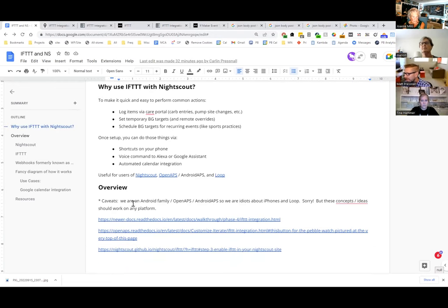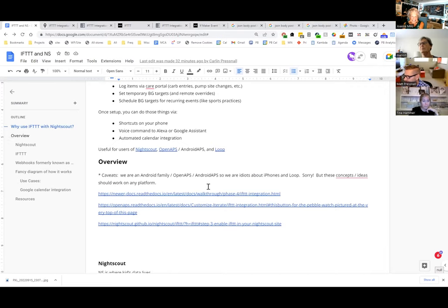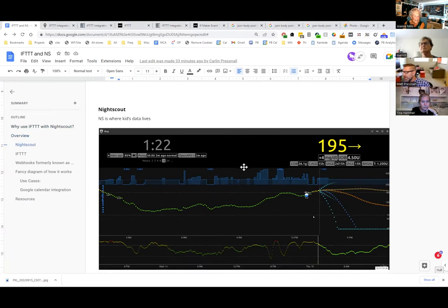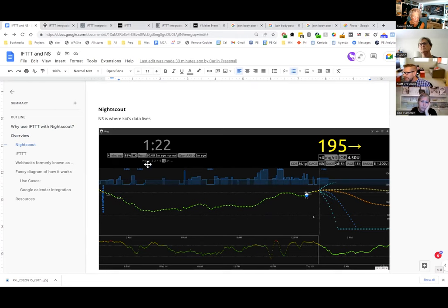Just a caveat — we are an Android/AAPS household, but these concepts should work well for anybody. Nightscout is where our data is visualized, showing what's going on with insulin usage, pump usage, and BG. It's the source of truth for all data related to type 1 diabetes.